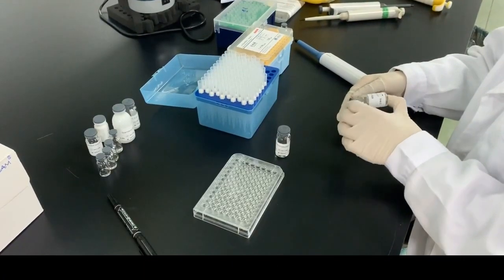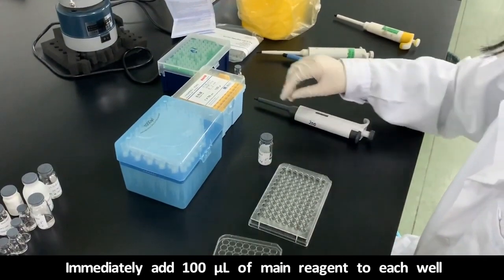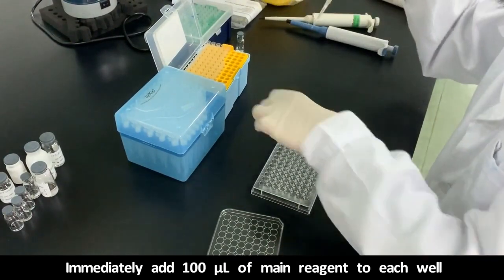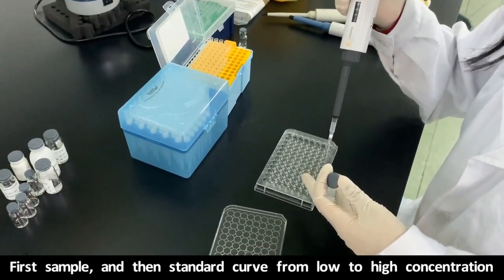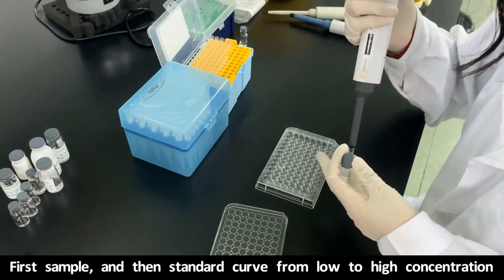Then this main reagent is added to all of the wells at a volume of 100 microliters. You start with the samples and move to the standards afterwards.